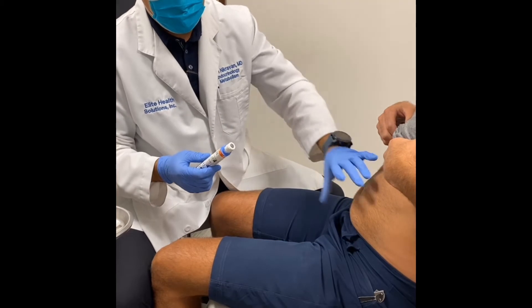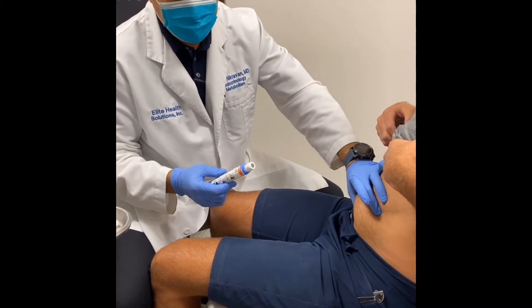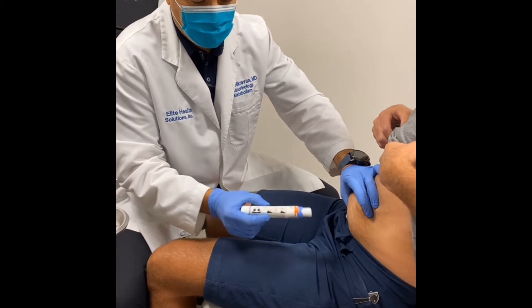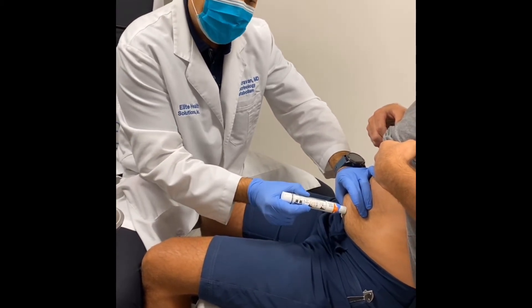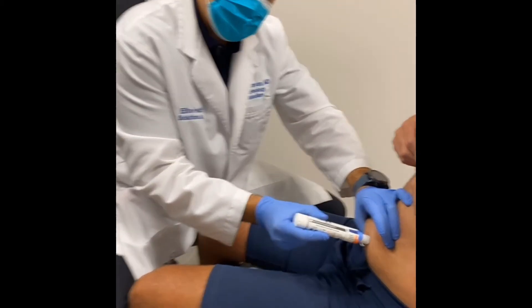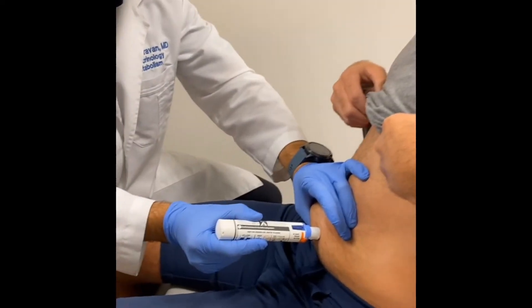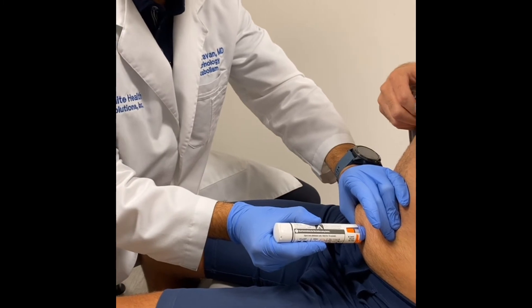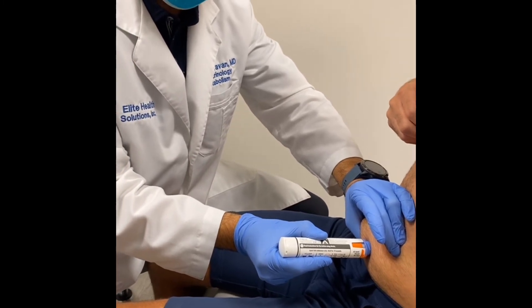The best way to give this injection is to grab above and below where we used the alcohol swab. You pinch above it and press the injector against the skin. You push against it and go like that — it makes a click, and as you can see the plunger is going down. Pretty soon it makes a click.